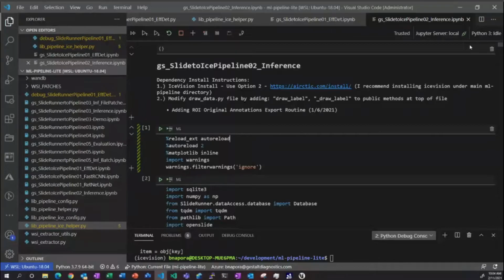The question is, are you sampling just from mitotic figures or from the complete whole slide image? Because that's quite important for training for mitotic figures. For this illustration, just the mitotic figures.